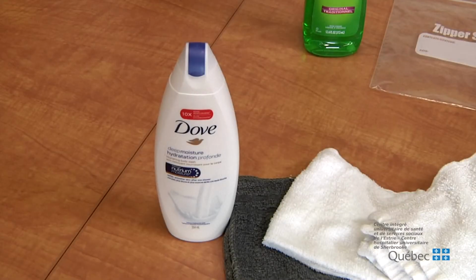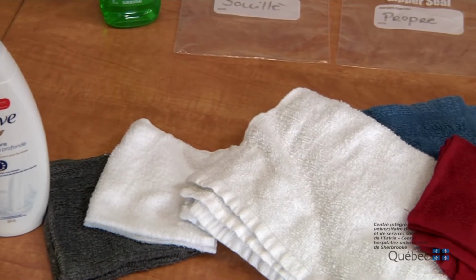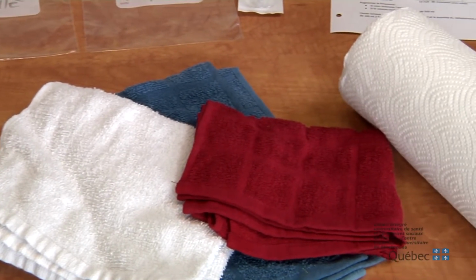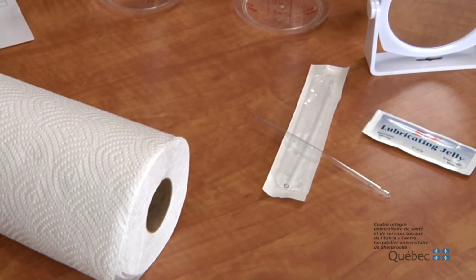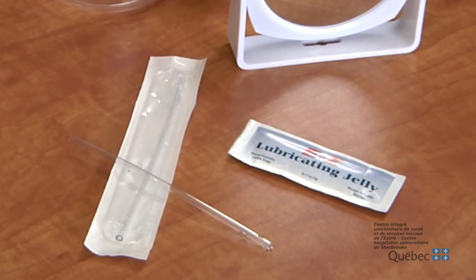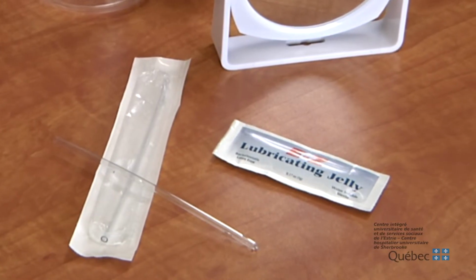Let's take a look at the materials that you will need to perform this procedure. A mild liquid soap, such as Dove or Cetaphil. Tap water. 2 washcloths. 2 or 3 hand towels, depending on the location selected. You can use a paper towel instead of one of the hand towels. Short urinary catheters for women. As you can see, the tubes are thin and flexible. The nurse will tell you which catheter to buy, how many you will need, and where you can purchase them.